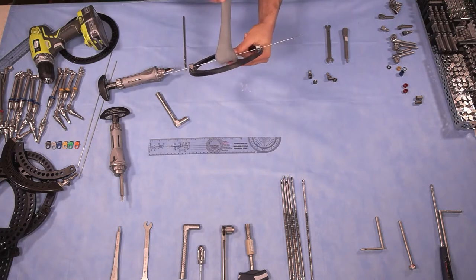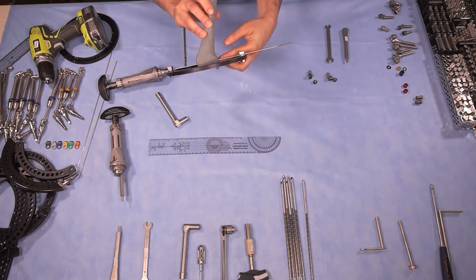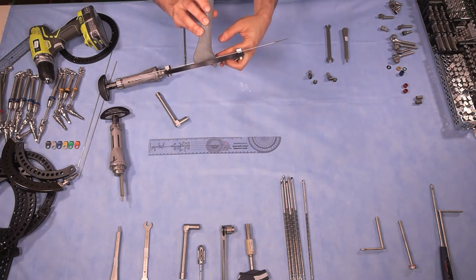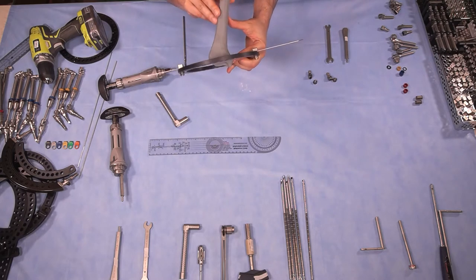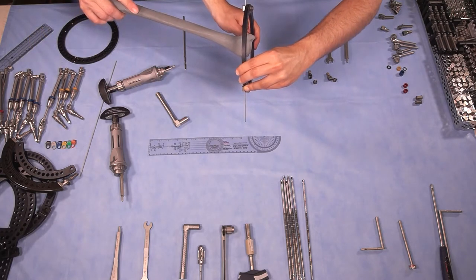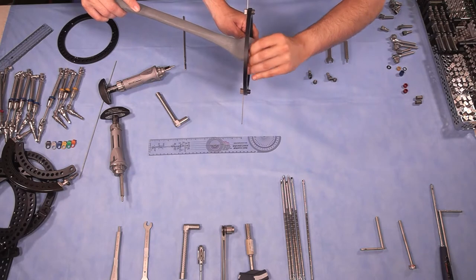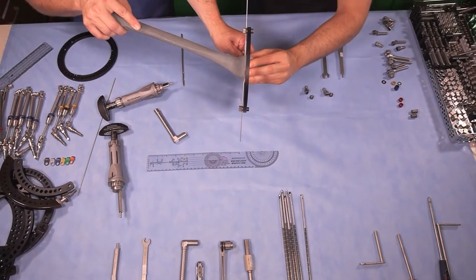We're going to insert the second wire from posteromedial, being very mindful that the neurovascular bundle is right behind it, going to anterolateral. You have to be mindful that the neurovascular bundle may be in your way, and you must make sure to avoid it and be anterior to it in a safe position.